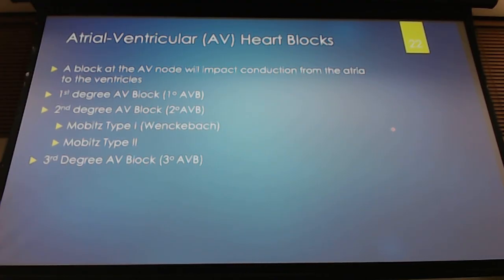Right. So that's it. We've got our junctional, we've got our ventricular. Junctional, typically going to be more narrow, either no P wave or inverted P wave. Okay? Ventricular, wide QRS, much slower heart rate. You might see some P waves, oftentimes buried within those QRS complexes, but it's going to be that wide QRS complex you're going to see coming from that.